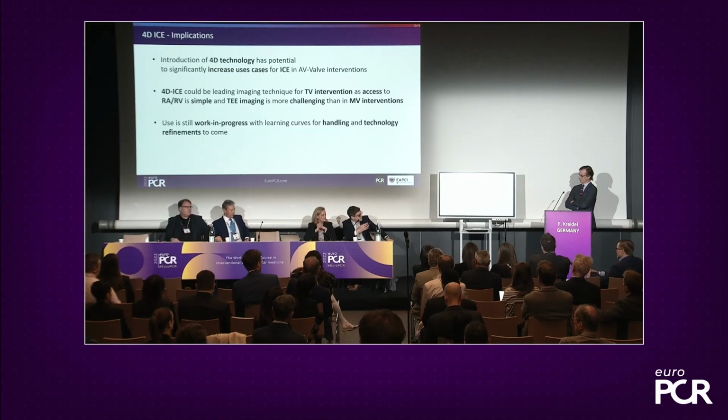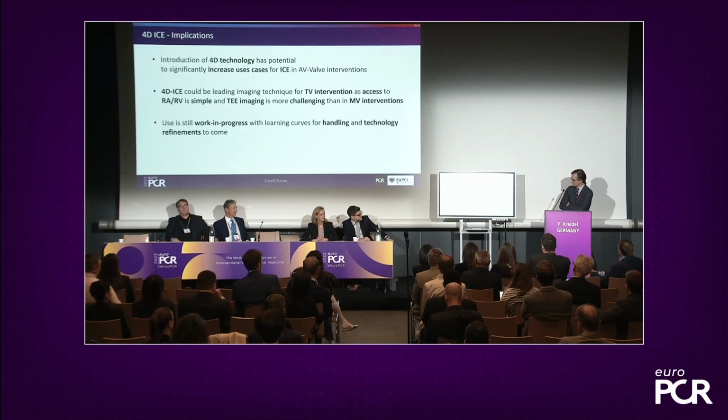Maybe, Felix, one question for you, and then you can sit down if you want, for the rest of the discussion. Why are we talking about ICE so much now? What is the new thing in technology that makes it easier to use, in particular for the mitral and tricuspid valve? Yeah, as mentioned, I really think the 4D technology is making the big difference.